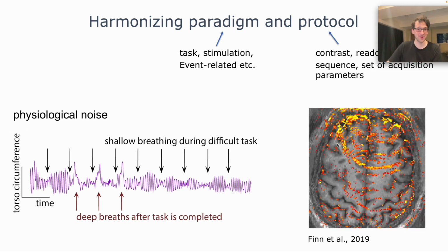So for example, when you look at your activation maps for this kind of experiment, you do see that in this tiny part of the brain where we would like to see our representation of this alphabetization, it's right under this artifact. You're not really clear. There could be something, maybe not, maybe yes, I don't know. So what can you do about that?